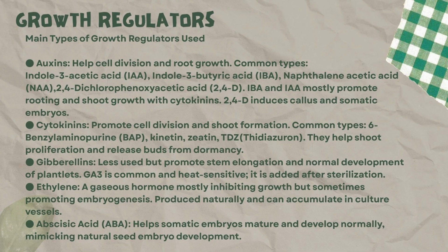Gibberellins, primarily gibberellic acid GA3, are not used as often, but they are crucial when you want to promote stem elongation and normal plantlet development.